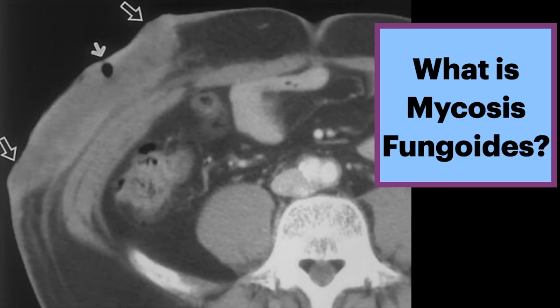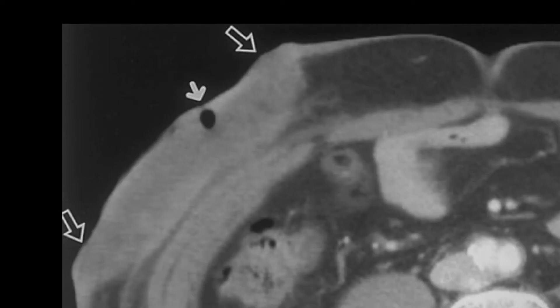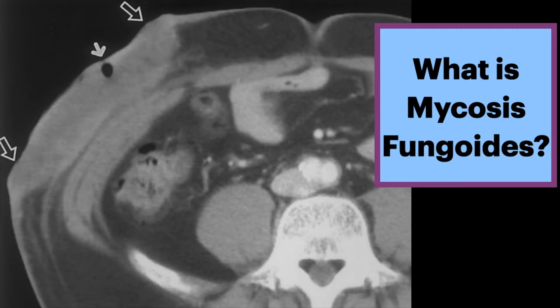On imaging, pay particular attention to skin thickening or cutaneous lesions. This axial CT shows a large tumor denoted by the open arrows in the anterior abdominal wall. This tumor involves the skin and subcutaneous fat. Note the small air bubble suggestive of an ulcer, shown by the solid arrow.